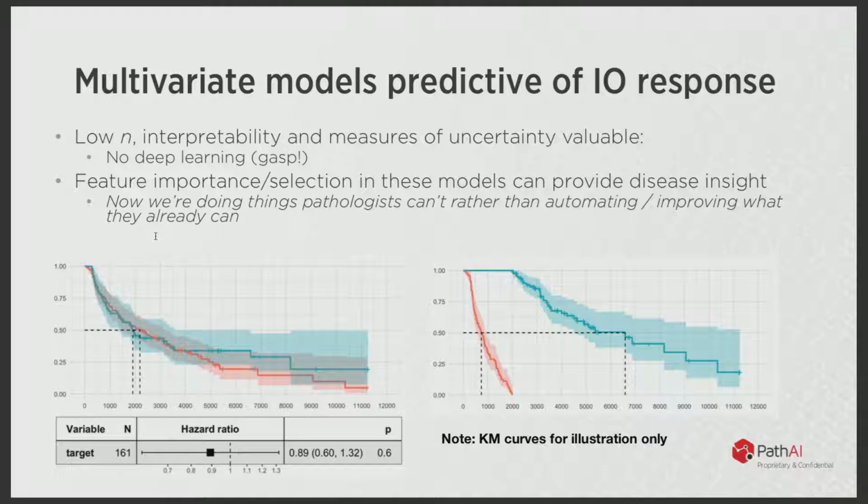But this would be one example where the output of the model, and this is totally fake data, but I think it gets to the point, is here the color indicates the treatment, where green would be the immunotherapy, red would be the traditional therapy. And the goal is to build a model to predict which patients actually benefit from the therapy. So this may be an easy question, but what do you think, if the model's working, what would the title of the graph on the right be versus the graph on the left? If these are the ways of classifying patients with our model. And the classifications are going to be responder class or non-responder class. And the color indicates the drug.